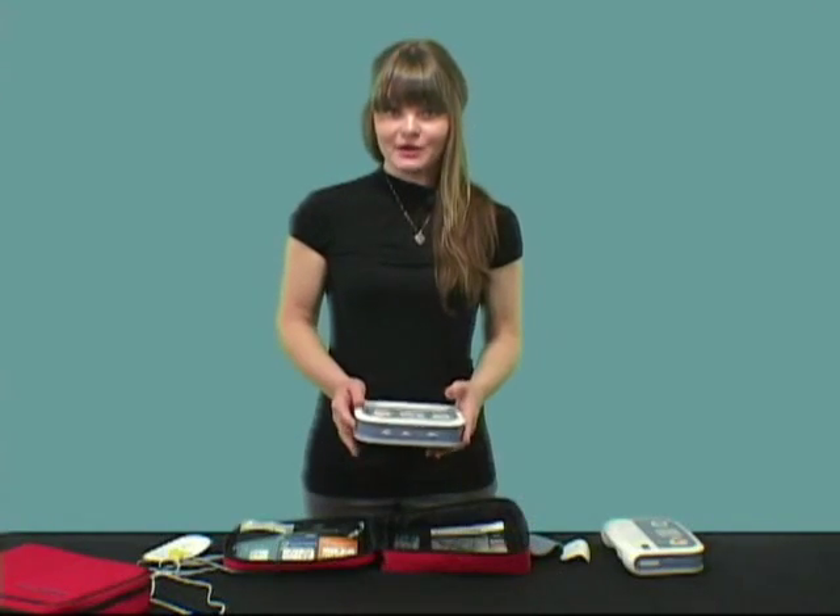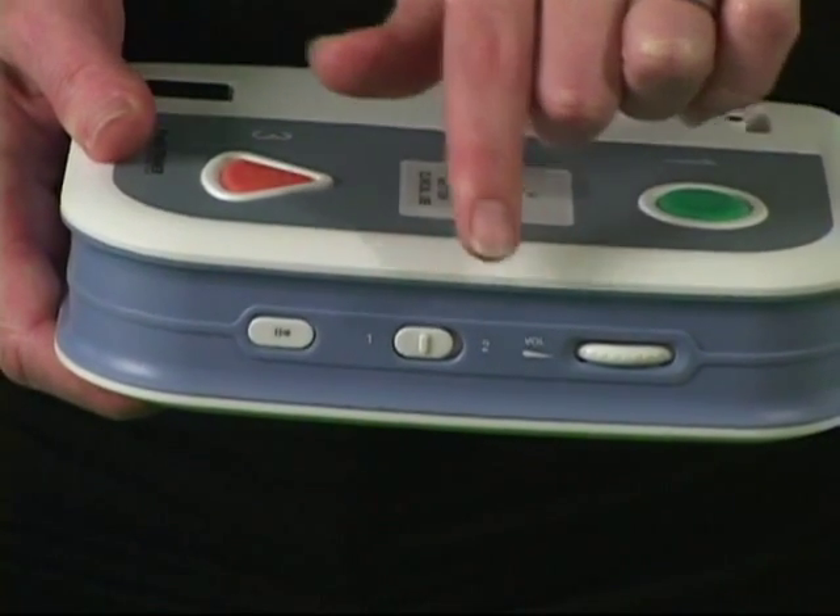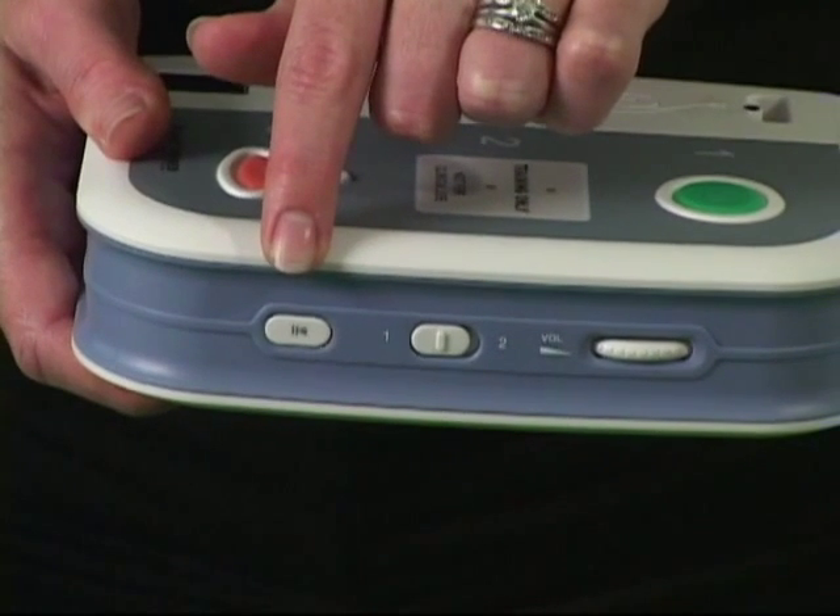On the side panel, you will find a volume control, language selection, and a pause/continue button.